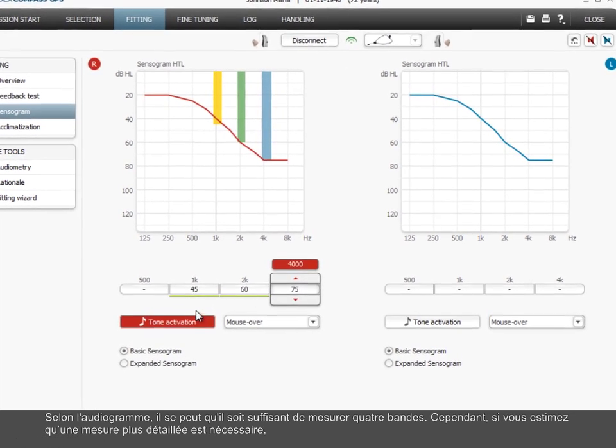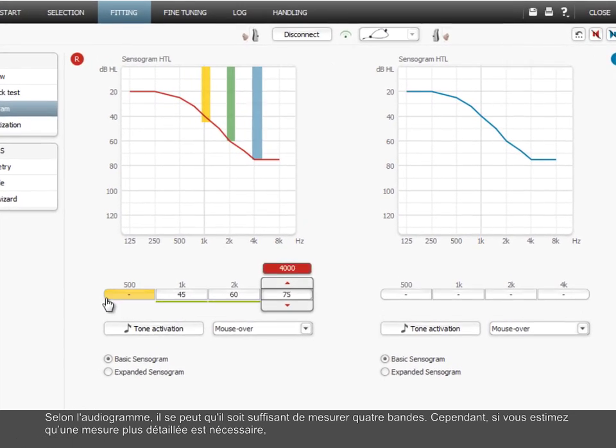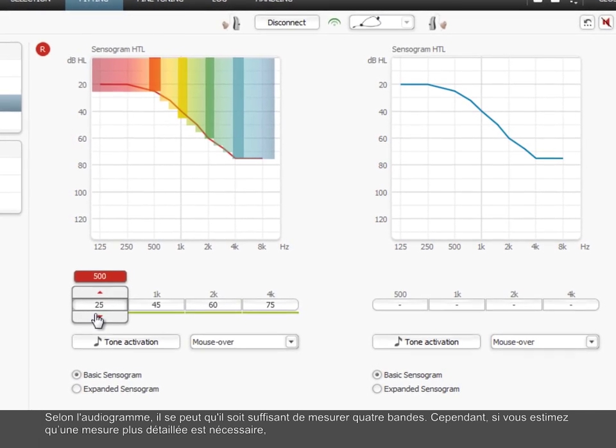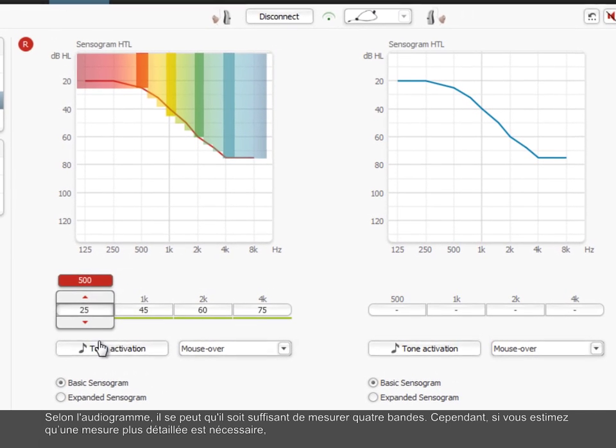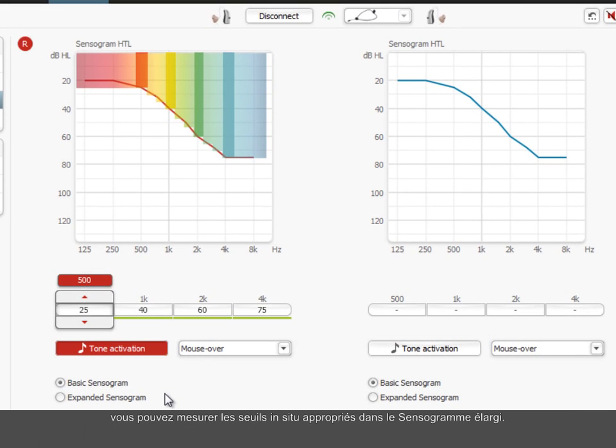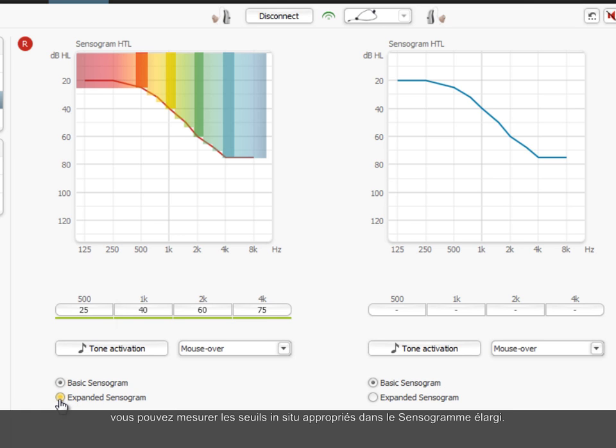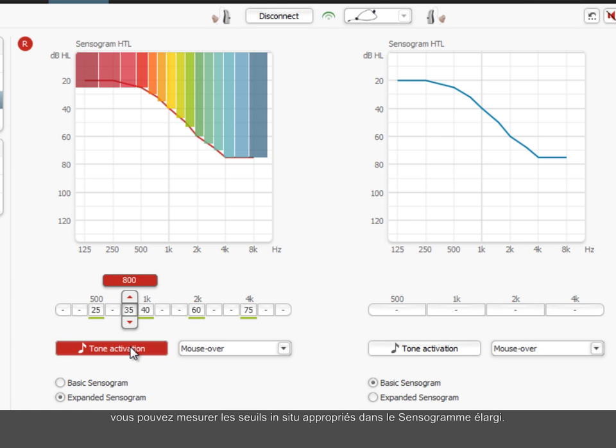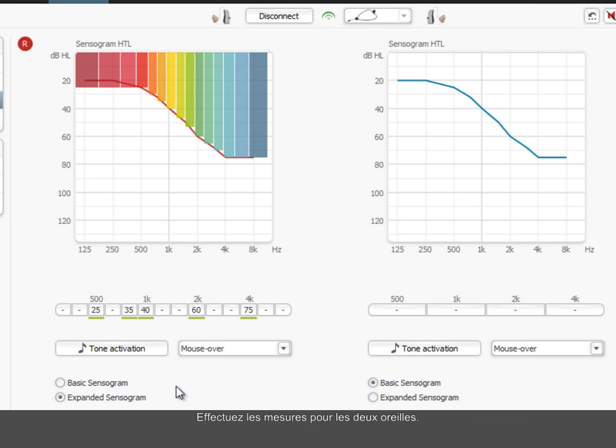Depending on the audiogram, it may be sufficient to measure four bands. But if you assess that a more detailed measurement is required, you can measure the relevant in-situ thresholds in the expanded sensorgram. Perform the measurements for both ears.